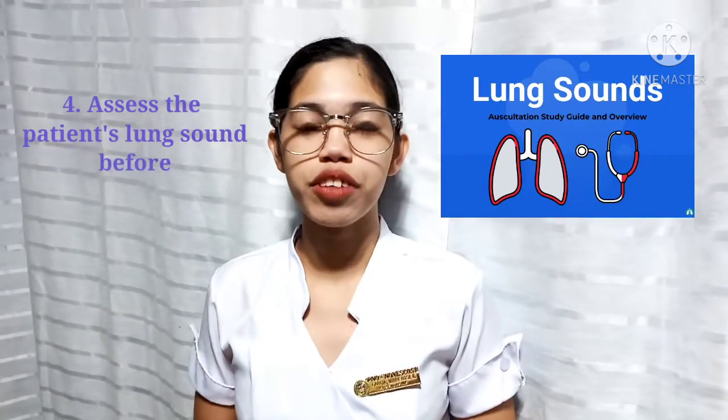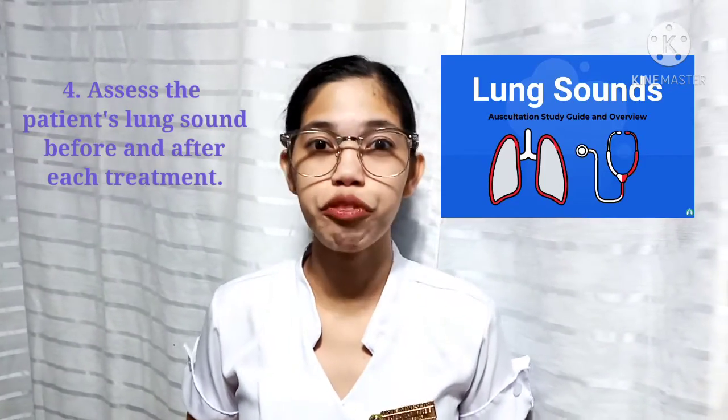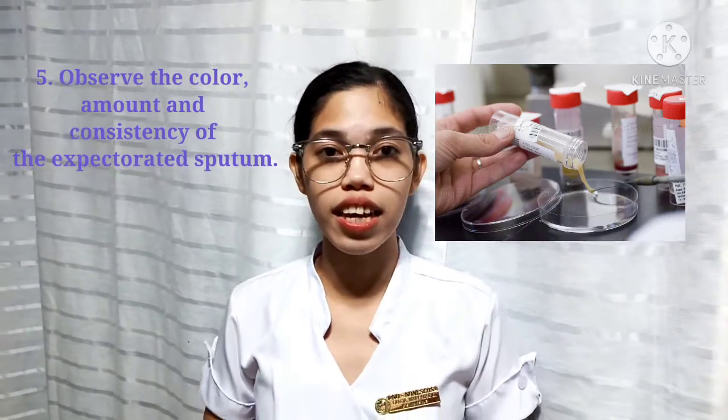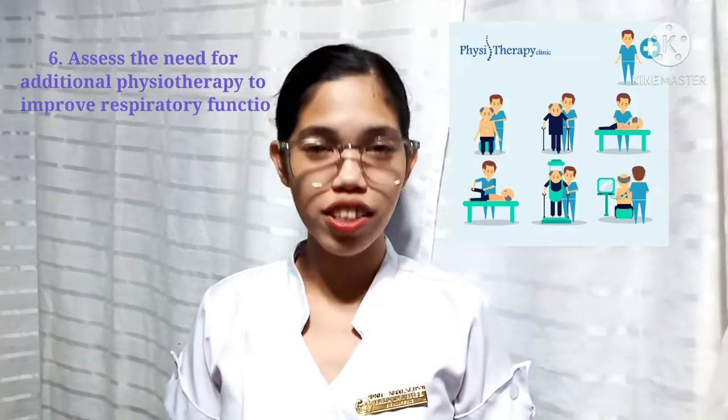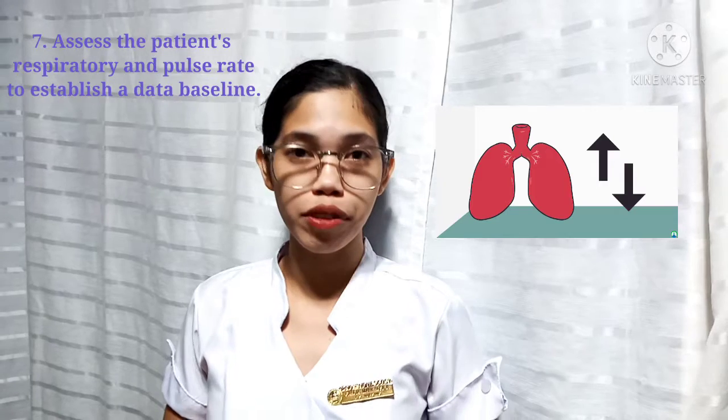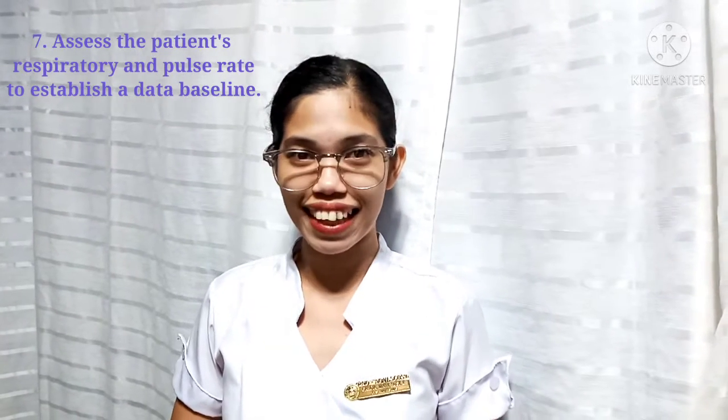Fourth, you have to assess the patient's lung sounds before and after each treatment. Assess or observe the color, the consistency, and the amount of expectorated sputum. Also assess the need for additional physiotherapy to improve respiratory function, and assess the patient's respiratory and pulse rate to establish a data baseline.